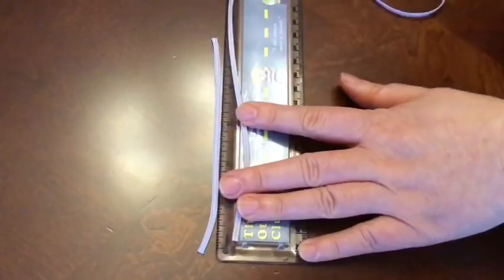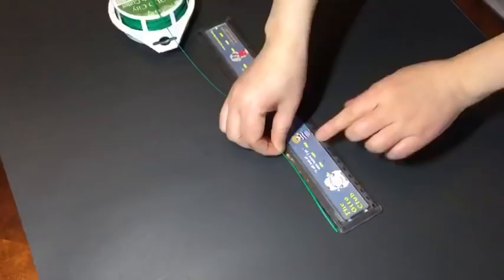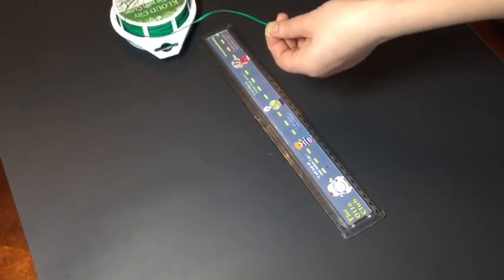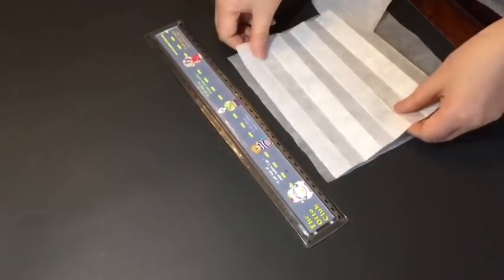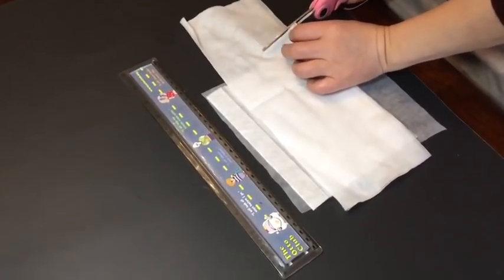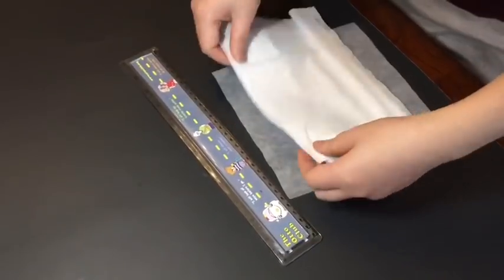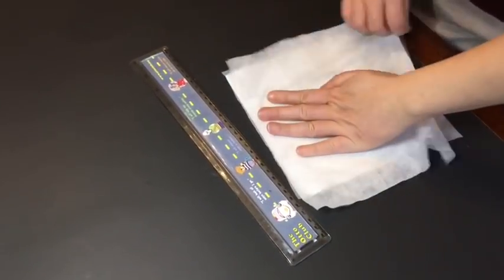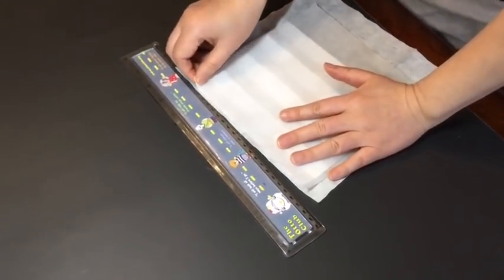I'm going to sterilize everything to the best of my ability with some hand sanitizer, since we're also in a super alcohol shortage — just wiping everything down and hoping for the best. Since these aren't going to be used for medical usage, just personal use, it should be okay. I'm cutting two pieces of rubber band to the desired length, cutting some wire, and layering the three fabrics on top of each other. The outermost layer goes on the bottom, then the filter, then the non-absorbent fabric on top.